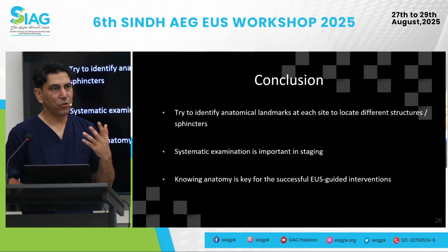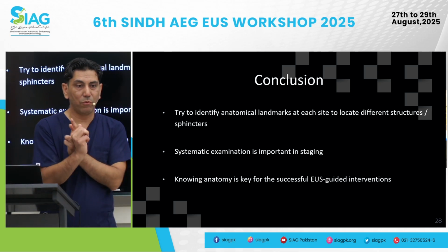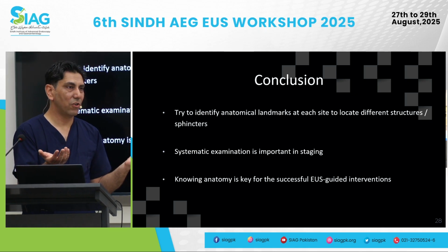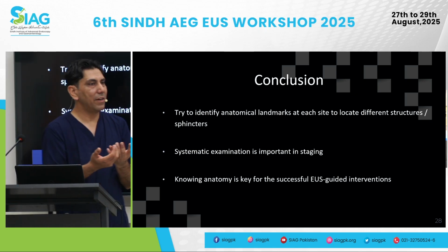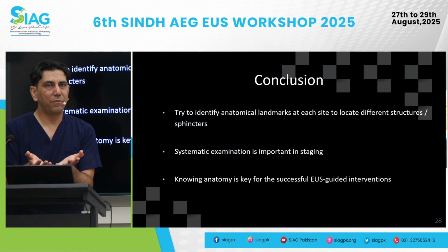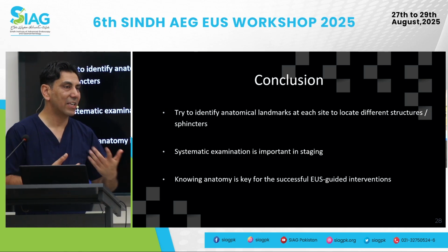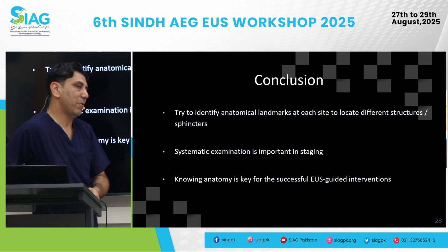And the important thing is, in our practice, the last 2 patients that I did before coming here: one was rectal varices, and the other was a patient where we did collection drainage of the perirectal area. That wasn't difficult to identify, it was easy to offer the therapy, and it essentially had a clinical implication. So a lot less diagnostic and a lot more therapeutic.